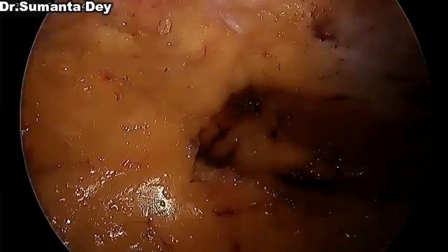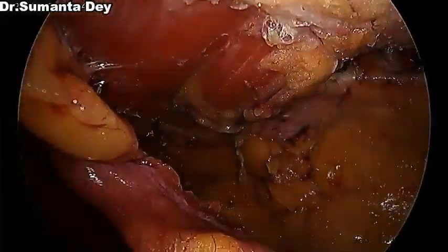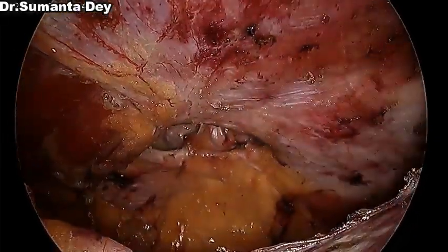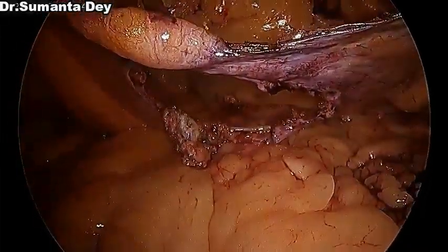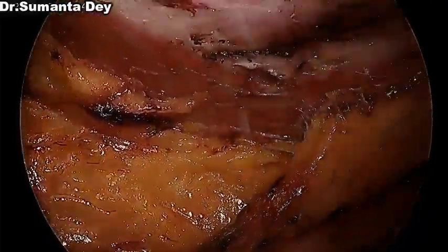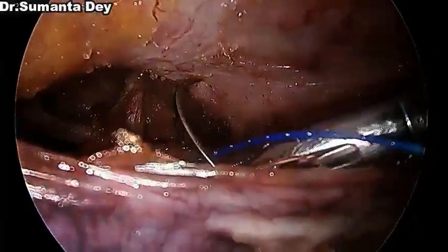Now I'm looking inside the hernial cavity. You can see there are large hernial cavities there, and the arcuate line is visible with the rectus muscle, epigastric vessel, peritoneal rent. All you can see, and this is the space of Retzius, the space of Bogros, and approximately 5 centimeters dissected.